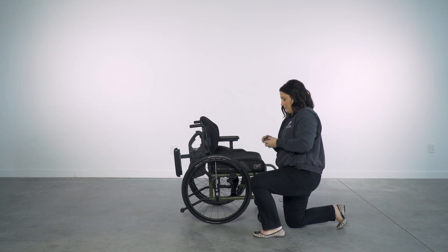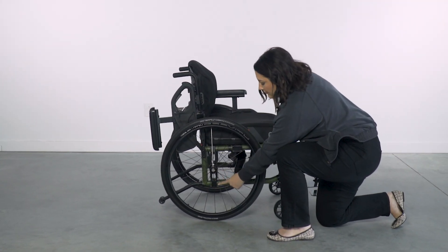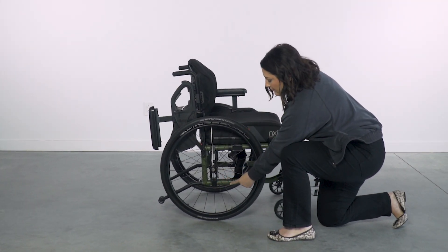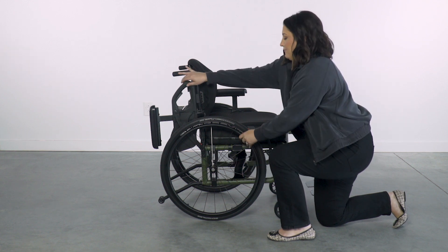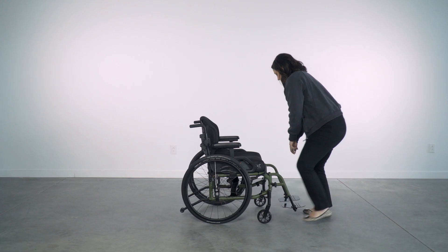Different wheelchair models will have different ranges of center of gravity. For example, this chair can achieve a maximum of four inches. Different models will vary in the range of center of gravity and the increments for adjustment.